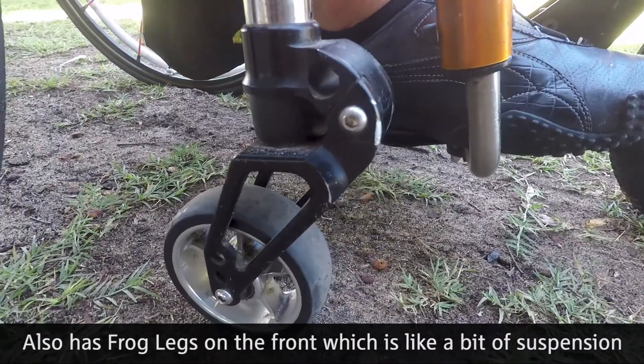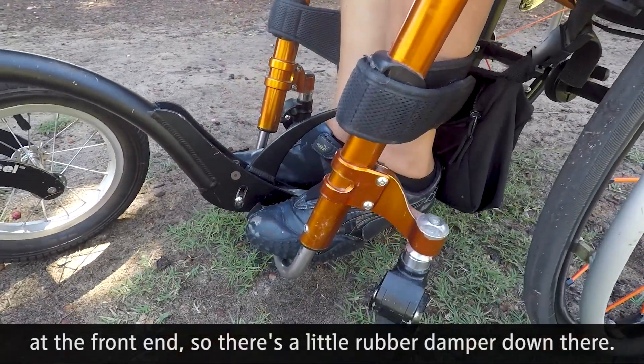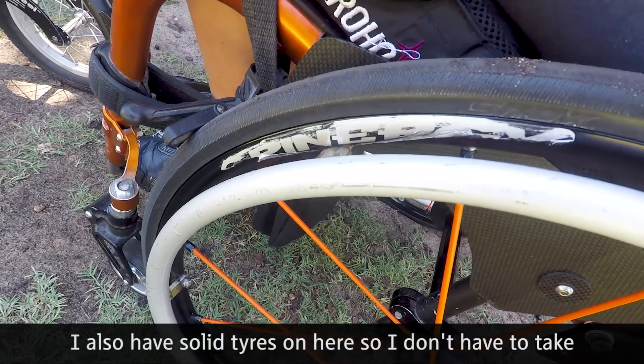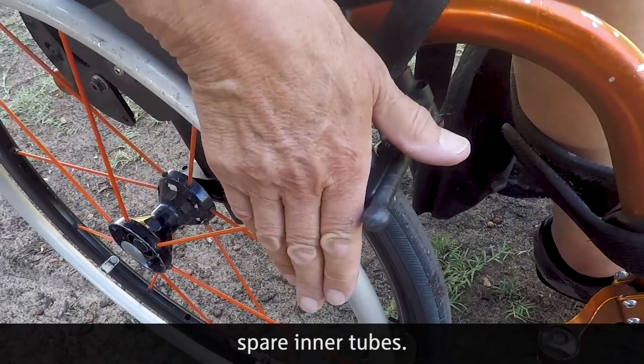It also has frog legs on the front — just a bit of suspension — with a rubber damper so on rough surfaces it bounces rather than jarring. I also have solid tyres on here so I don't have to carry spare inner tubes.